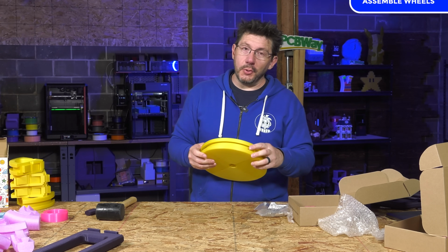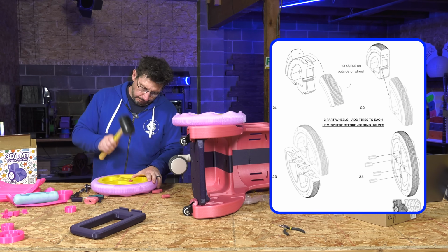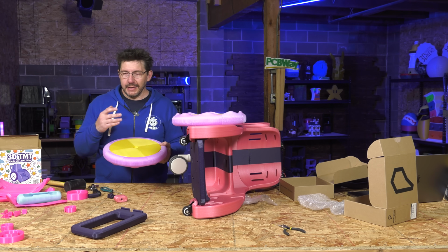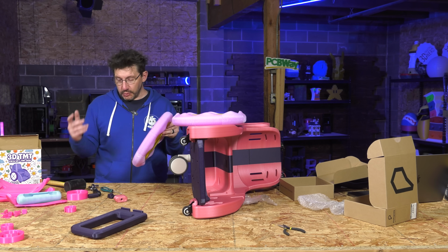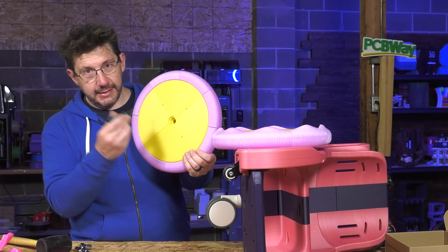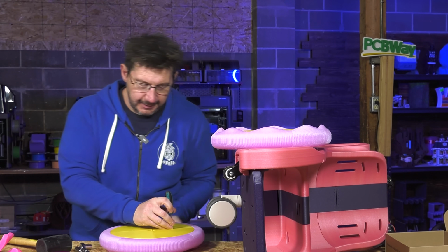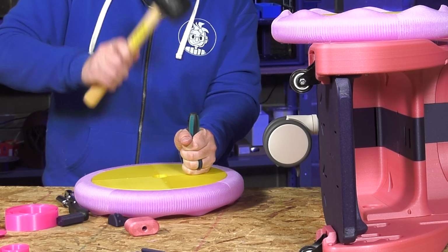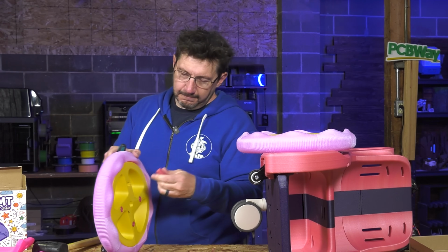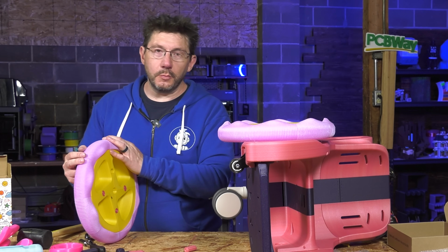But first, what we want to do is put the tread on. I can show you how these are built to be disassembled in case you want to change colors or fix something. There's holes on the front of each of the wheels, and if you get, in this case, an Allen key, an Allen driver in there, you can butt up against that and then give it some taps. And that starts to come out. And now it's out. I just need to do it to the other 3. I can take everything apart and then I can put it back together.